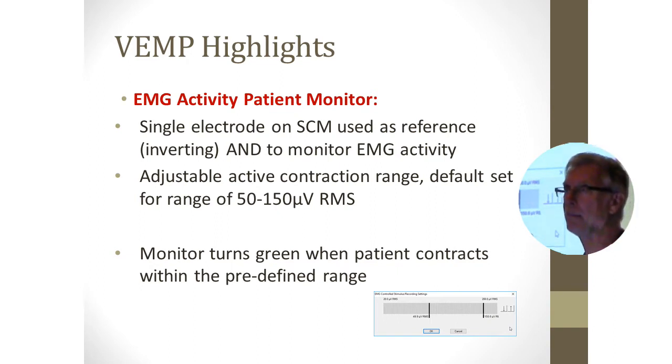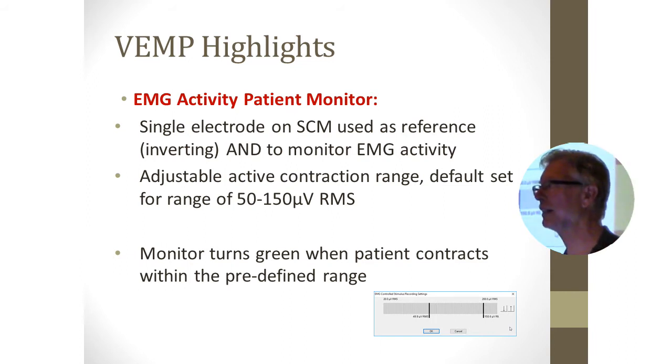In fact, I've used that and tried the different techniques that we've used over the years, and yes, it's very easy to get it wrong when you're just turning the patient's head like we used to do. But when you have them lying supine, raise their head up so they can see their feet, and then turn and look at their shoulder, then it's almost automatically equal. I didn't know that was equal.